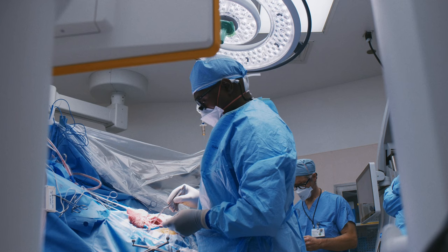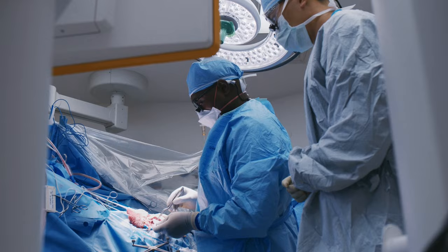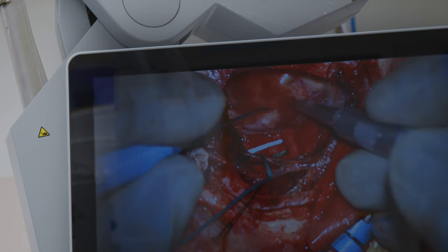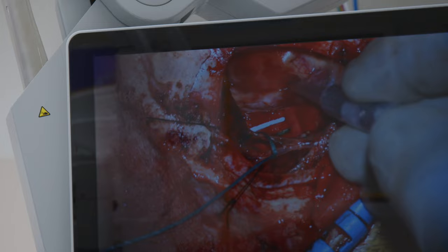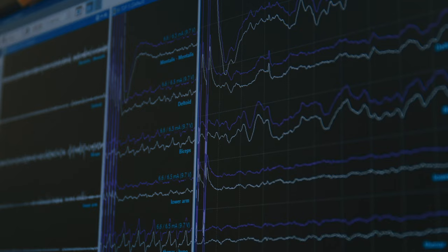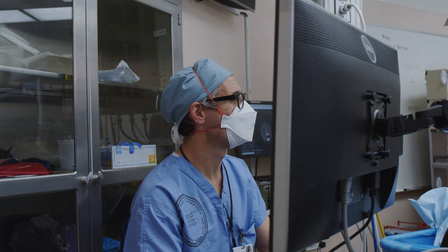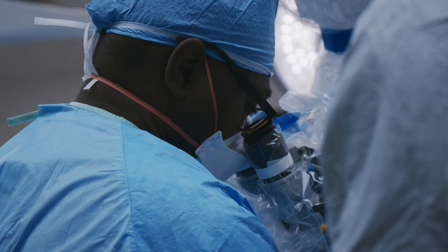After we finish the language mapping portion of the procedure, we proceed to the motor aspect. We have little electrodes on each of the muscles of the arm, leg, face, and foot. With what we call a monopolar stimulator, we deliver a small electric charge. This electricity moves forward until you get a motor activation. We can gauge and continue to walk closer and closer to the movement fibers while we're moving tumor. Once we get to about four to five millimeters away from those movement fibers, we stop.